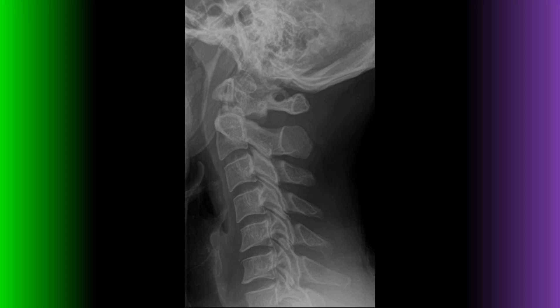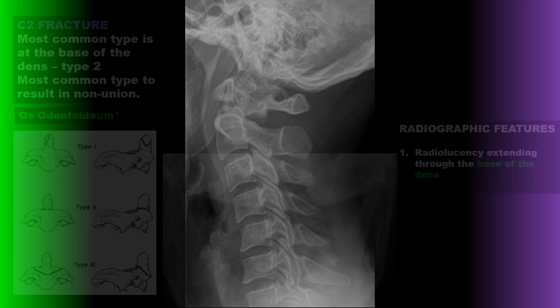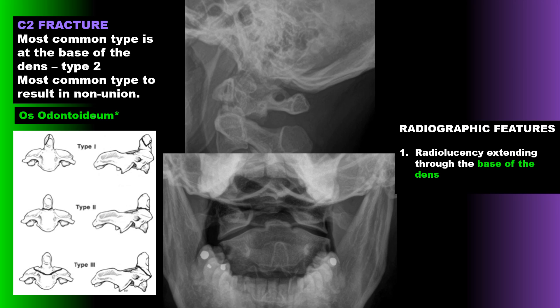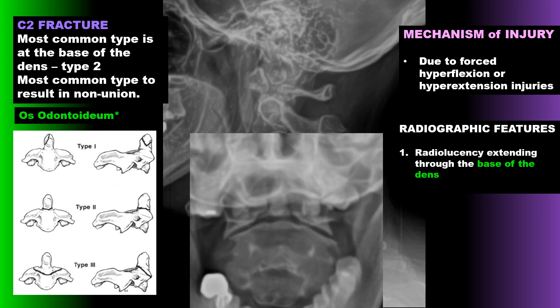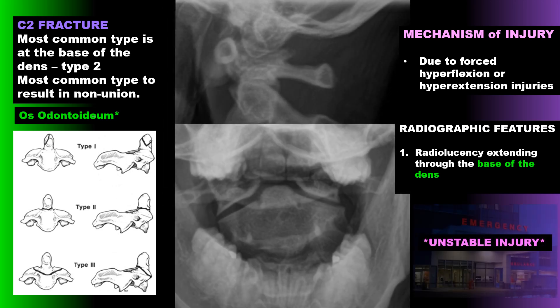Here's an example of a previous C2 fracture. One of the most common fractures of C2 is the base of the dens, and this is the most common type to result in a non-union, sometimes called an os odontoideum. Radiographically, we're looking for a radiolucency extending through the base of the dens. The mechanism of injury is forced hyperflexion or forced hyperextension. These fractures are an unstable injury and require neurosurgical consultation.